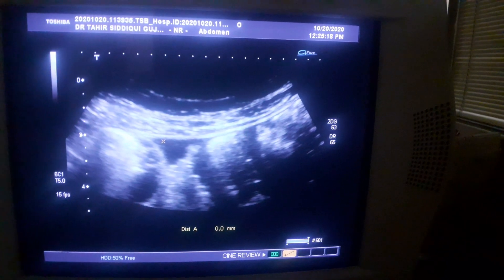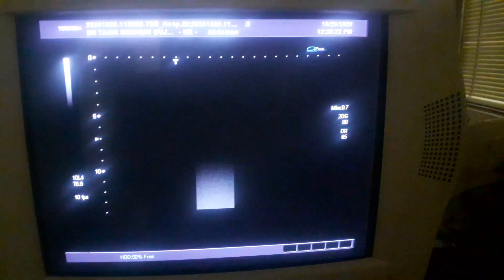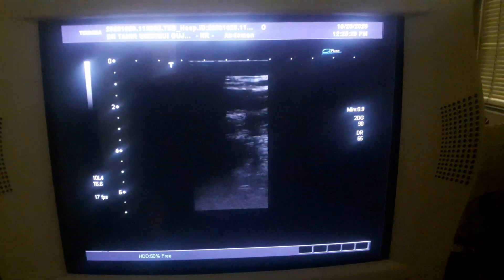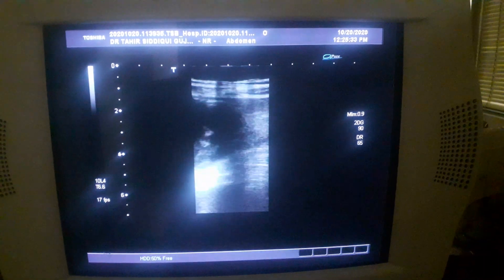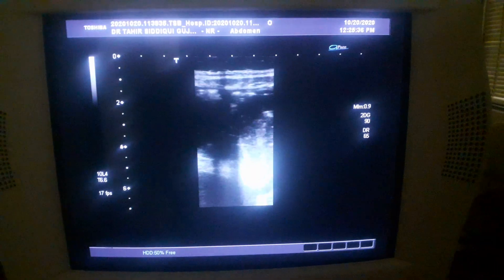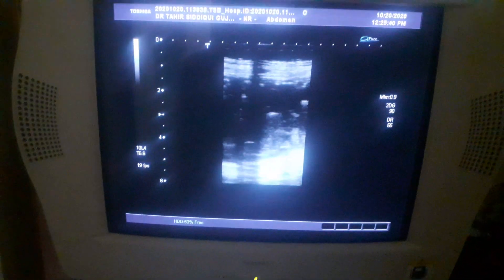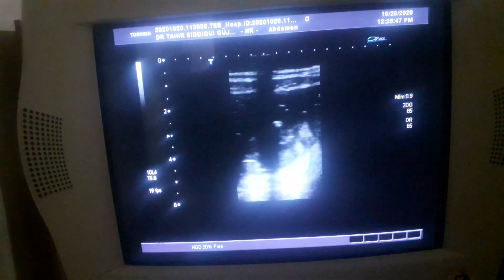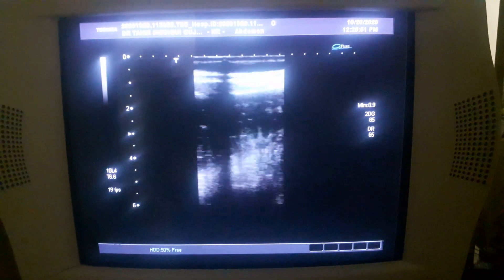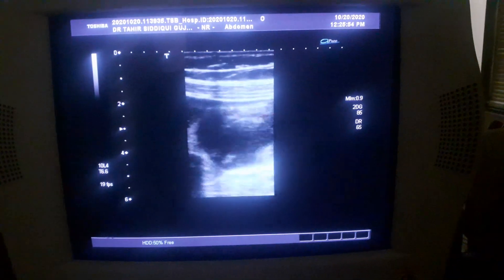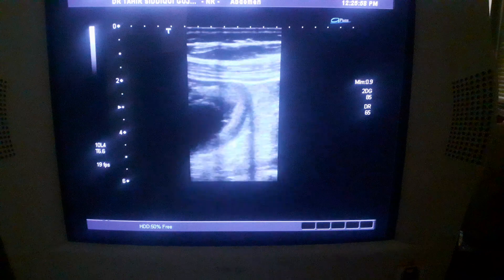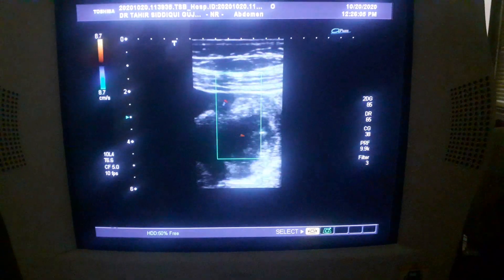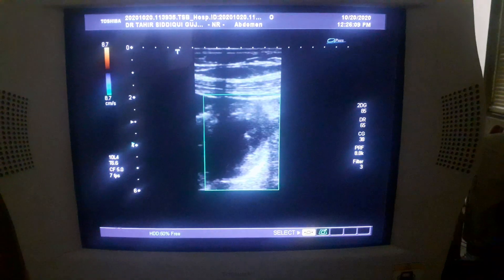Now let's scan with the 7 MHz linear probe, as it gives a better picture. You can now see the bowel segments clearly — these are the dilated bowel segments, the same ones I was showing you initially.